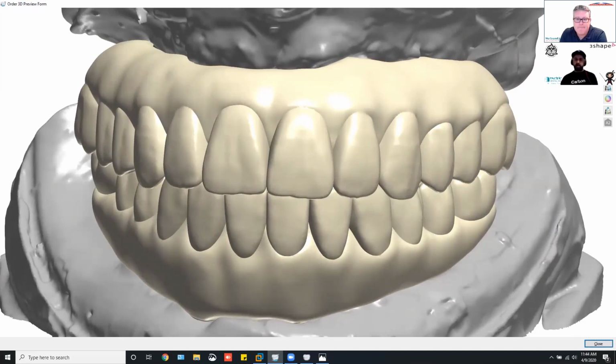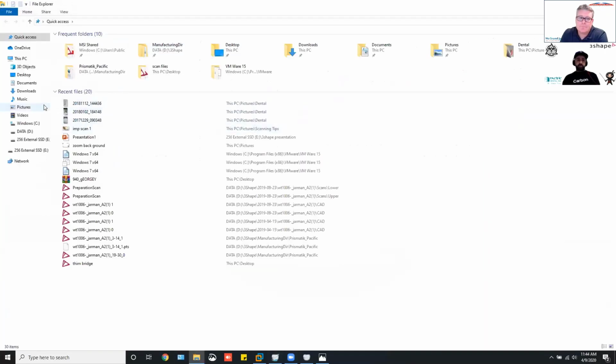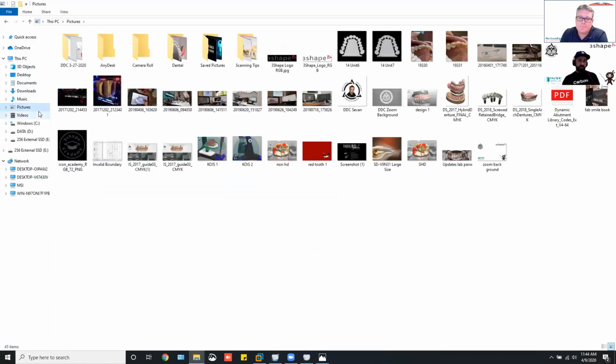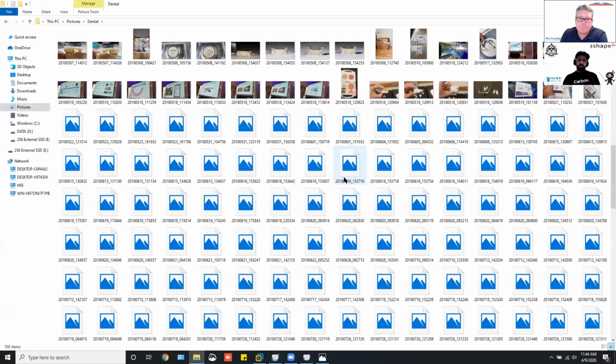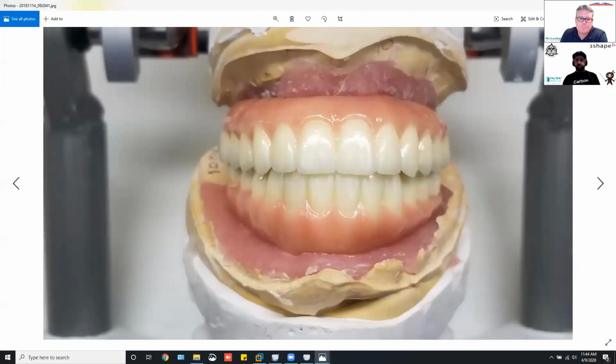And then the boss comes to you like, why is this? And you go, but it's not like this. And I have these issues a lot with veneers, wax veneers, because I have to put the sprues on the interproximal corners because, you know, where else are you going to put them? So it becomes hard, after you do all this work, and then the guy's like, well, where'd it go? It's like, well, it's not like that. This contour is off. And I go, well, that's where I put the sprue.